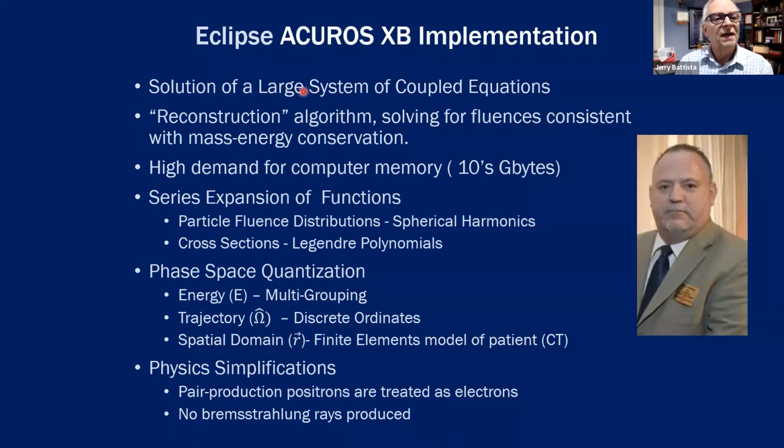I will ignore that. A large system of coupled equations are required, and I think of this as a reconstruction algorithm, solving for fluences consistent with mass energy conservation. Very high demand on computer memory, tens of gigabytes, a series of expansions of some functions, phase space quantization.